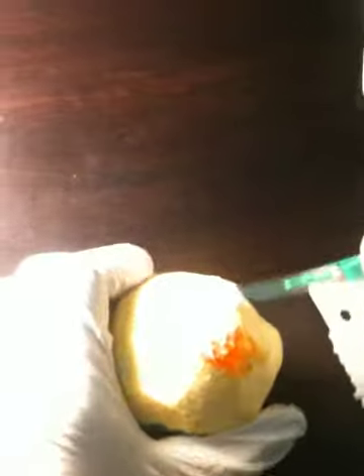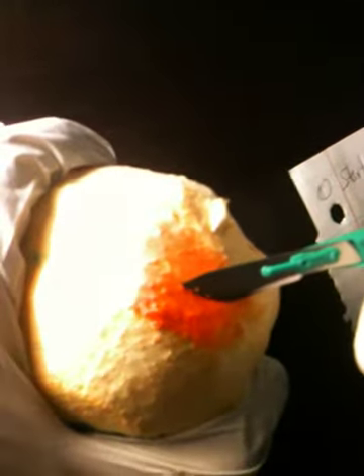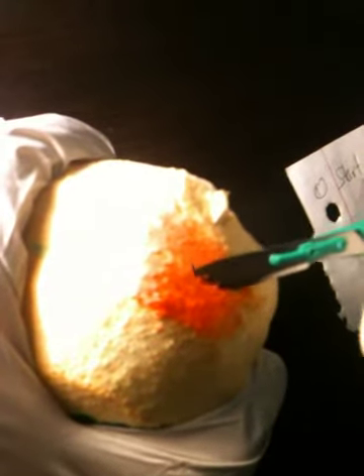So you have to avoid going deep where you can see the white tissue. Here you can see we removed some chunk of tissue on my scalpel, and we're going to keep it on a white tissue, and keep doing it, just to be sure that we are superficial enough and removing the dead tissue without damaging or hurting the patient, because if you go deep, you're going to go onto living viable tissue, causing damage to the blood vessels or the nerves, giving signs of pain and inflammation.